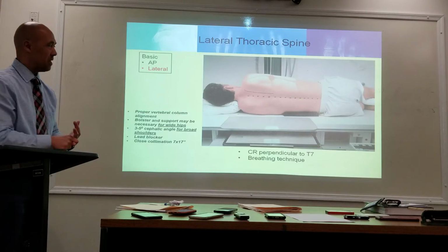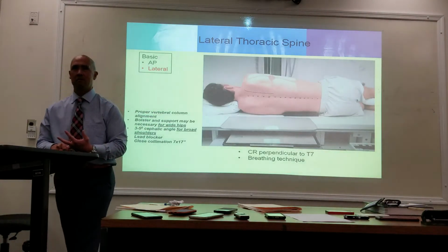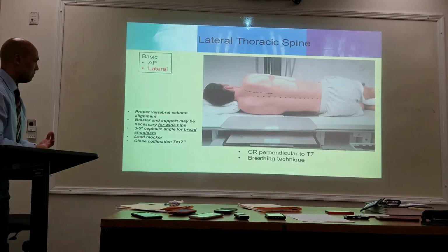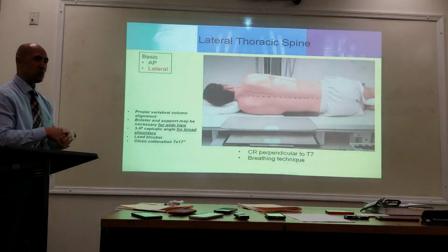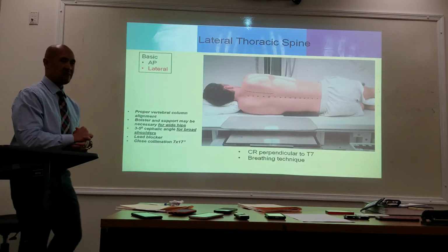Besides, do you guys have lead strips in your hospitals? Probably not anymore. All right. So again, collimate to an area of 7 by 17. You don't need a lot of field. You're going to center at the level of T7.